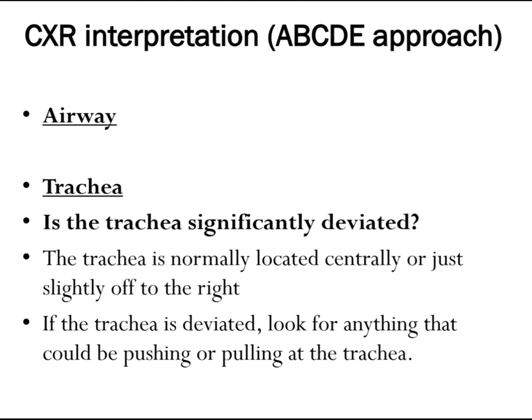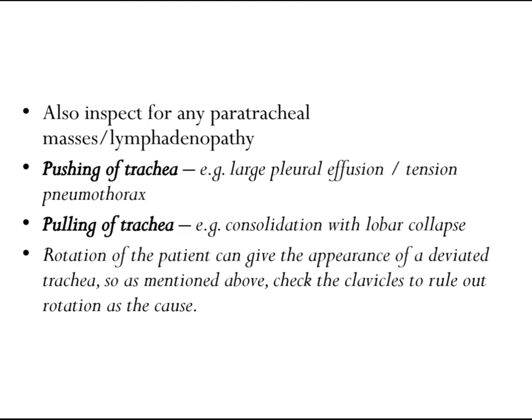Chest x-ray interpretation uses an ABCDE approach. A is for Airway. Start with the trachea — it is normally located centrally or just slightly off to the right. If the trachea is significantly deviated, look for anything that could be pushing or pulling it. Also inspect for any paratracheal masses or lymphadenopathy pushing the trachea, for example a large pleural effusion or tension pneumothorax pushing it away, or consolidation with lobar collapse pulling it toward the affected side.